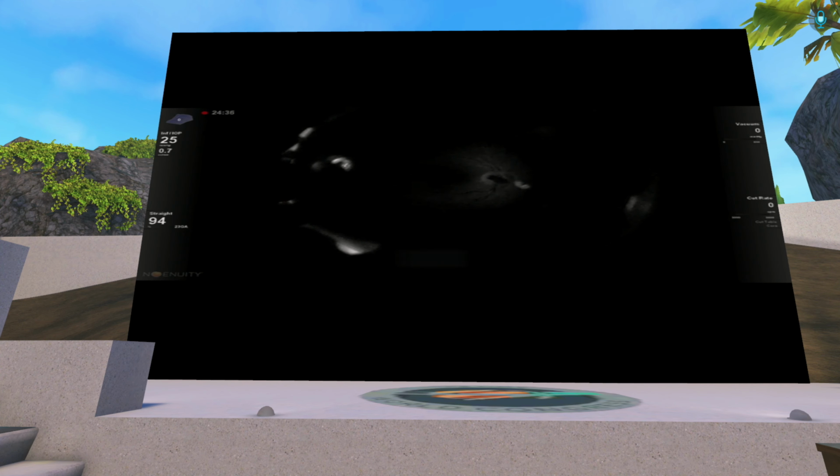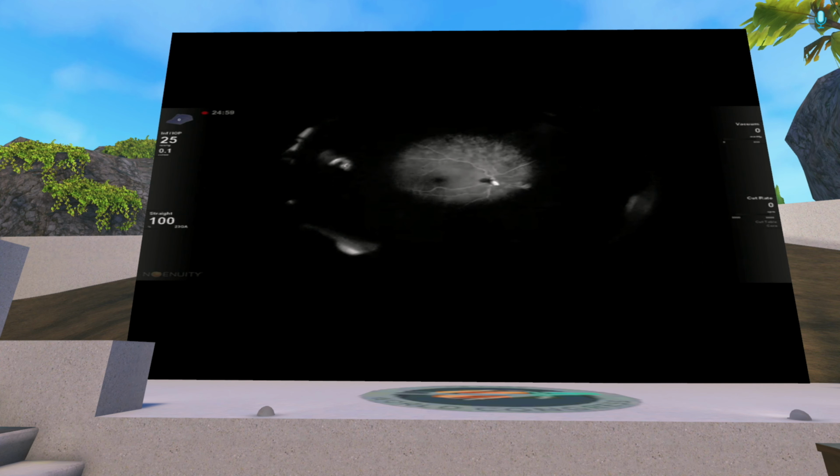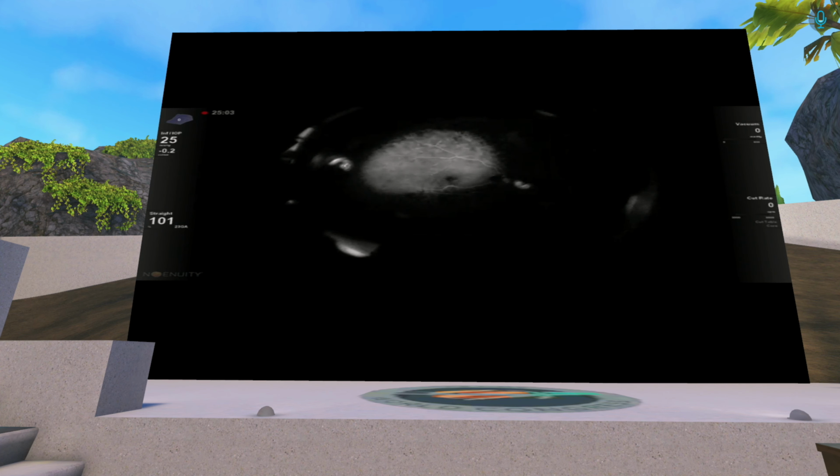This is a case of advanced proliferative diabetic retinal disease, where of course we will do first the fluorescein angio, and later on we will do fluorescein angio guided endolaser, and it will be done only under a chandelier light. I heard something about the blue light which was harmful for the retina.